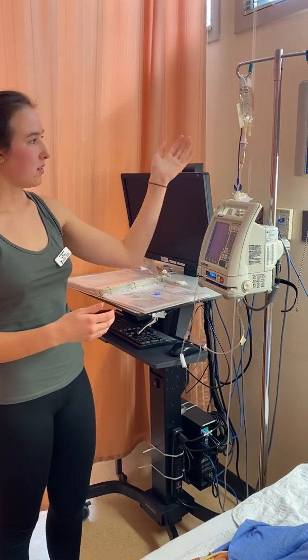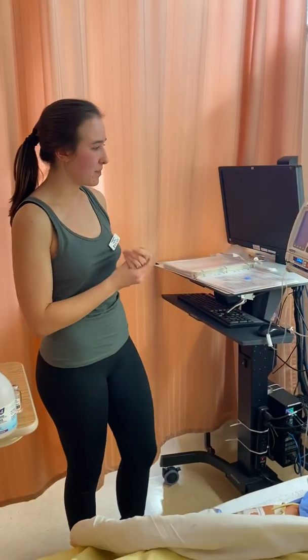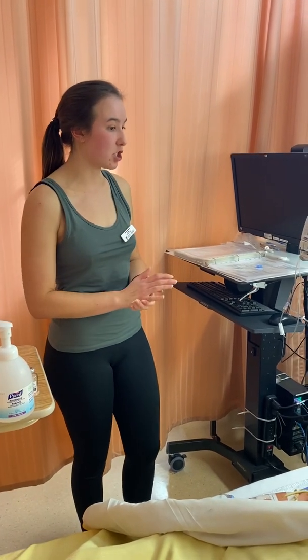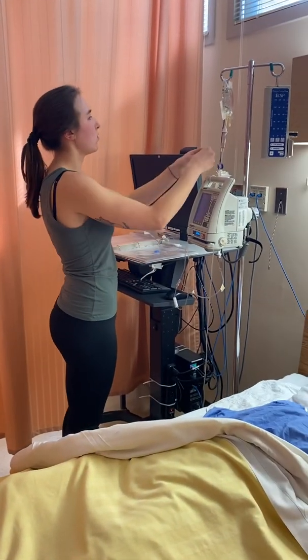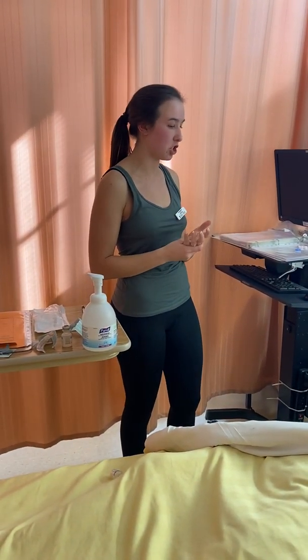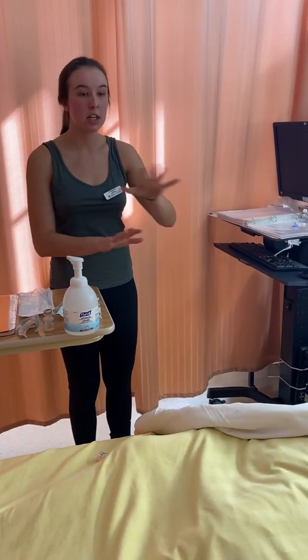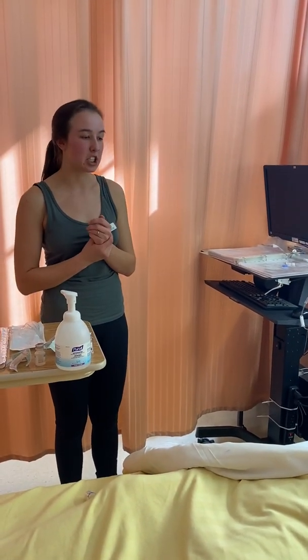Do you have any more known allergies? Once three drips have come through my drip chamber, I'm going to hand my patient the call bell, ensuring they're not experiencing any of the symptoms we discussed, and that they can call me if they do. I'm also going to label my tubing line so that everyone knows the correct and appropriate time to change the tubing. I'm going to sign my MAR with my initials, the date, and time. I'm doing my exit safety check, cleaning up the room and taking my MAR with me. My patient's bed is in the low position, they are alert and oriented, and they know to call me if they need anything. I will be back when the medication is done instilling.